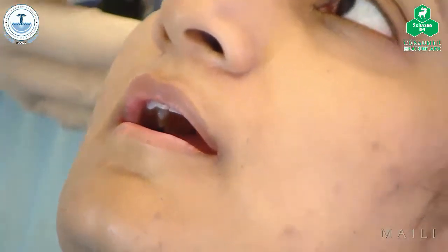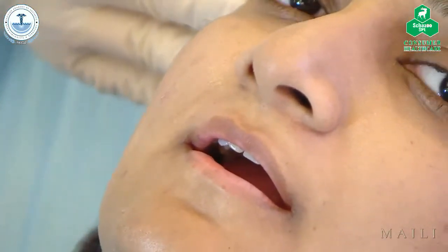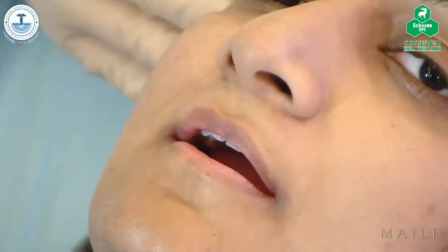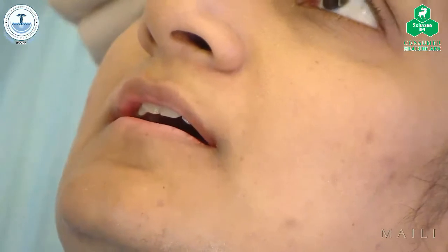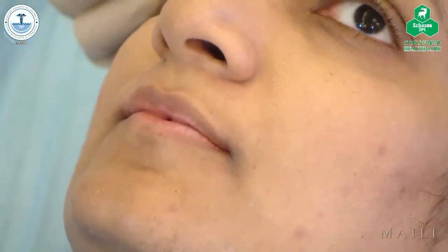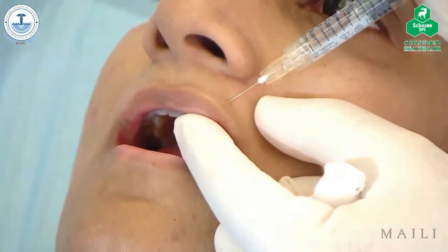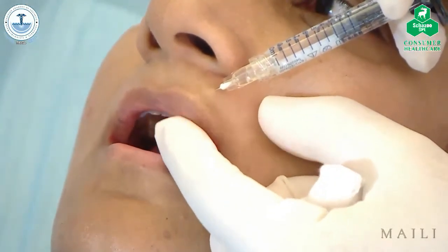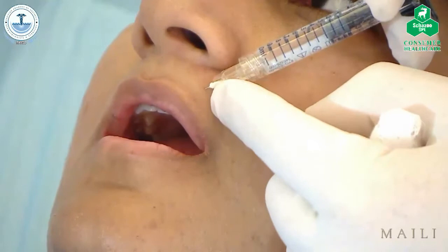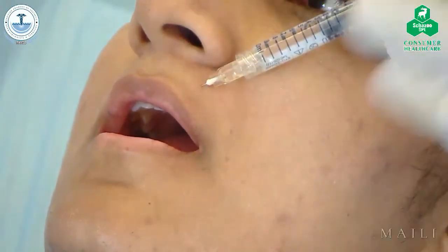This is nice. And you can see how it is everted with 0.1. Just 0.1? 0.1. What is happening is the bolus is on the mucosa side of the muscle, placed under the muscle, and just pushes it outwards. And do the same thing on this side. So your entry point is quite far away. Yes, because I want to go away, because if I go closer, actually I'm closer to the artery. So I'm just going in the back of it.